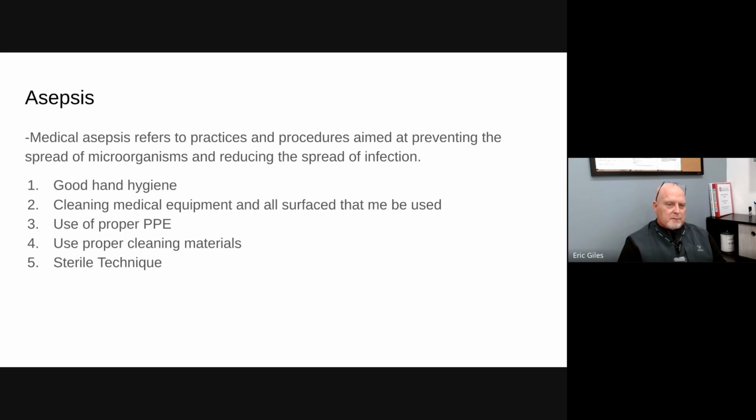The IR, we're always putting somebody's hand or something on the IR. Just keep it clean. Use the appropriate cleaner to clean it, and don't let us be the mode of transportation that somebody else gets sick. That includes the table, the tube, and the IR.